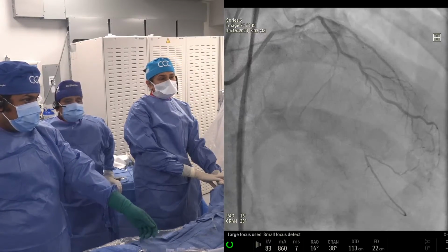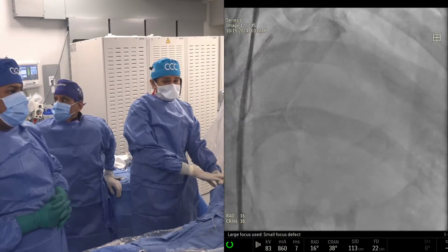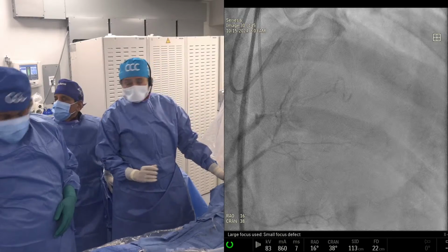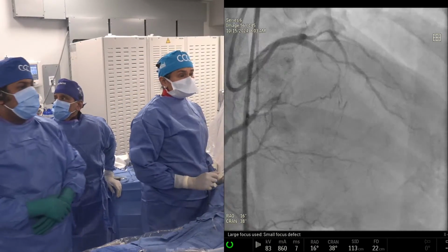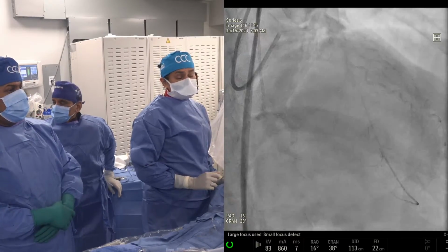Now the side branch. There is only one challenging issue there, that the septal, though it's small, there is a septal which can interfere into getting just into the CTO proximal cap, just at that level. There's a large septal. That's the only challenging part for us.